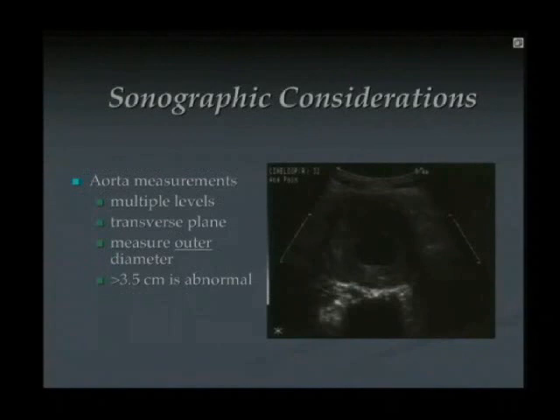I actually also like using ultrasound in a rule-in fashion. If I don't see an aneurysm, because it's elderly abdominal pain, and elderly abdominal pain just scares me, my practice is to CT those patients as well, looking for another serious cause of abdominal pain. Is it contrast or without? Depending on the scenario. Usually with contrast if they can get IV and oral contrast. But that's looking for other pathology, not the aorta now.